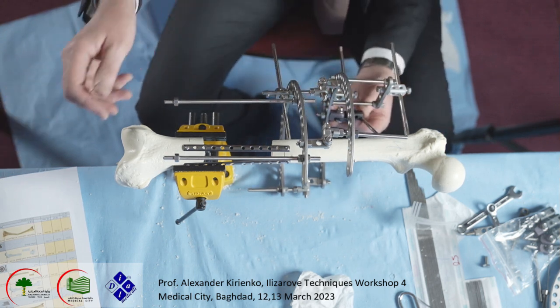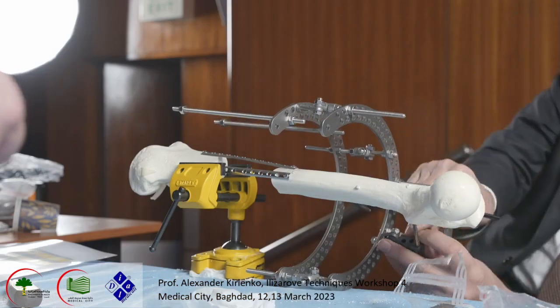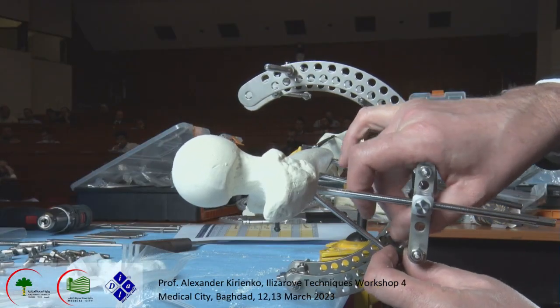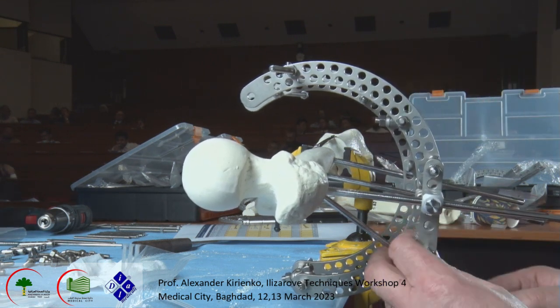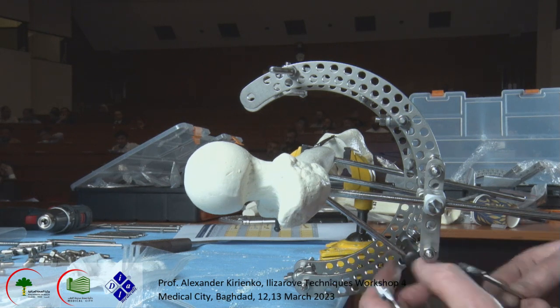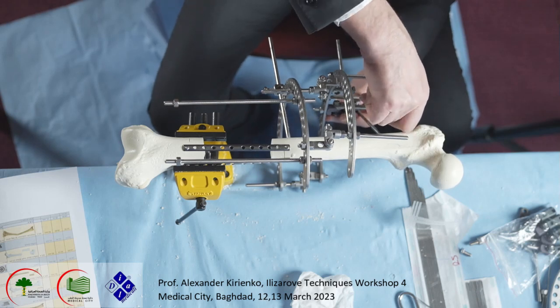Okay. We should add that. Small one. Okay, this way we fixed the half pin better. Okay. This is inclination. It's maybe not easy to introduce this half pin, but it creates more stability because it's like a triangular stabilization, you know, like an aircraft.